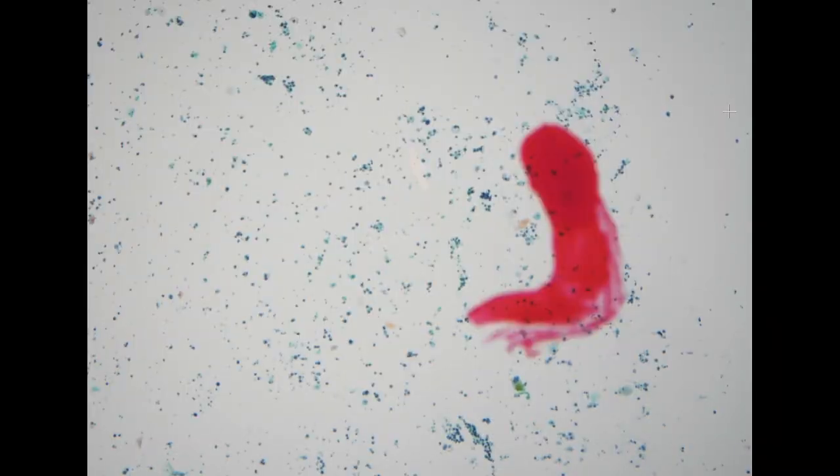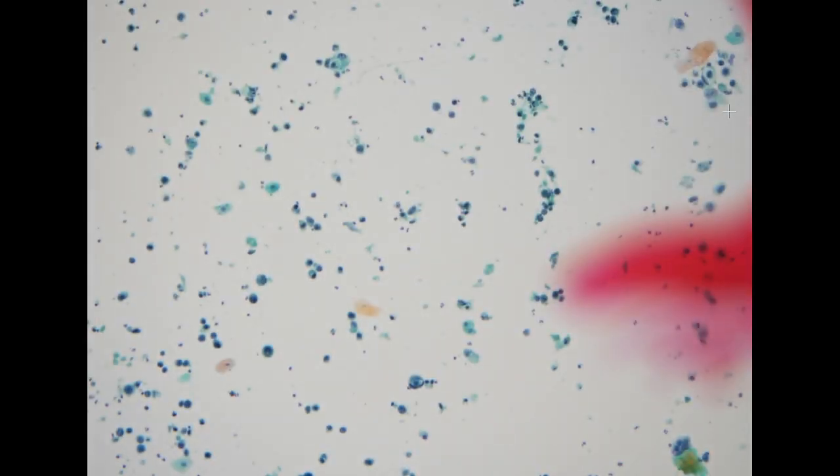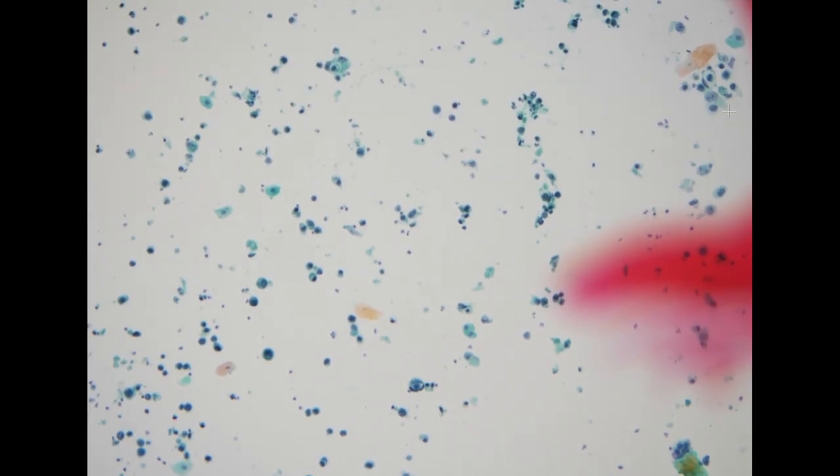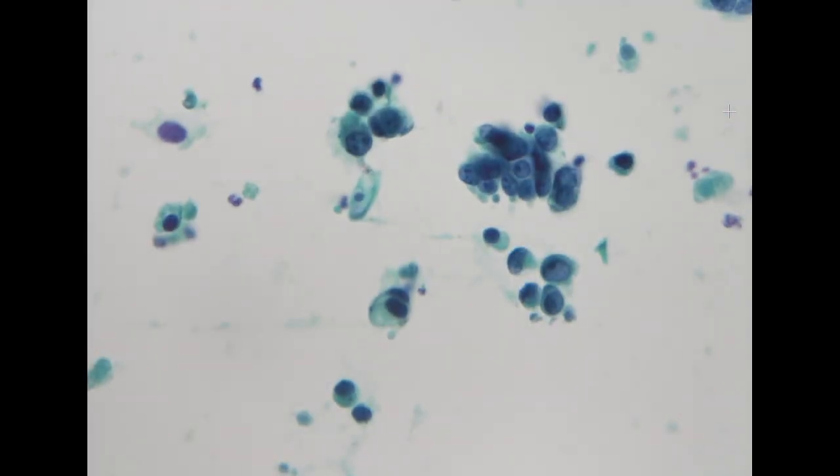The second specimen is also coming from a patient with a history of high-grade urothelial carcinoma. On low power, we can also see a similar picture with scattered loosely cohesive or single cells with very hyperchromatic nuclei. And when we go to higher power, these cells show definitely enlarged nuclei compared to the adjacent inflammatory cells, high NC ratio, polymorphism, and hyperchromasia.